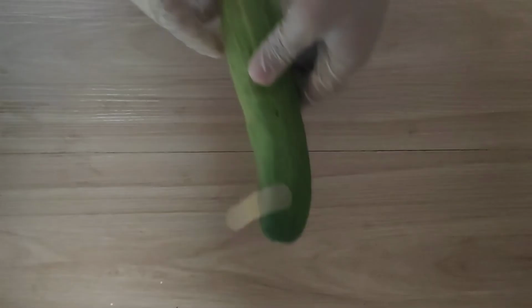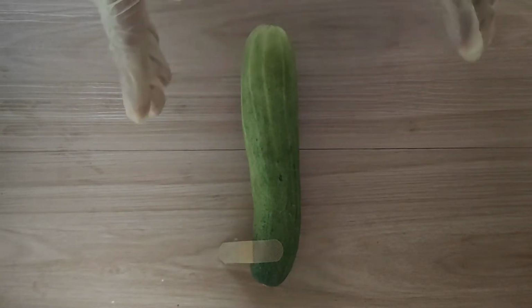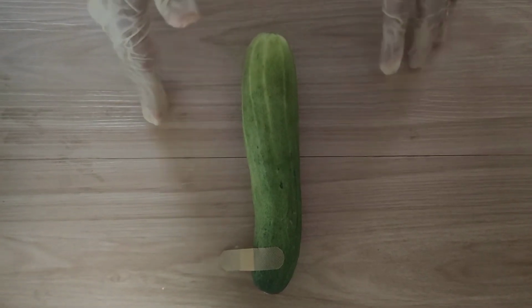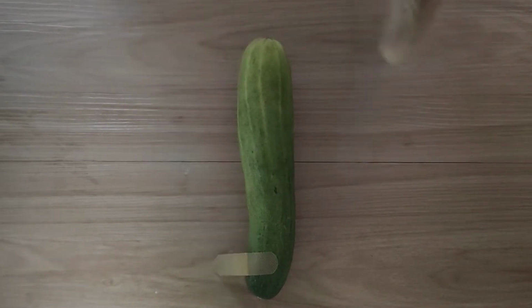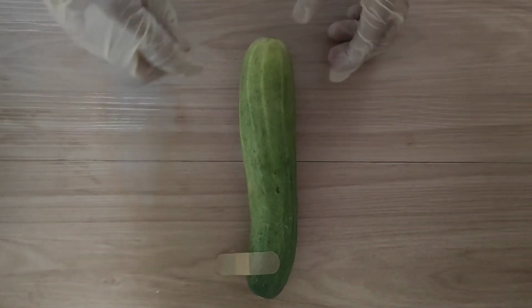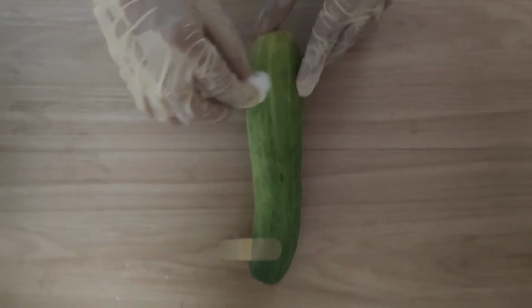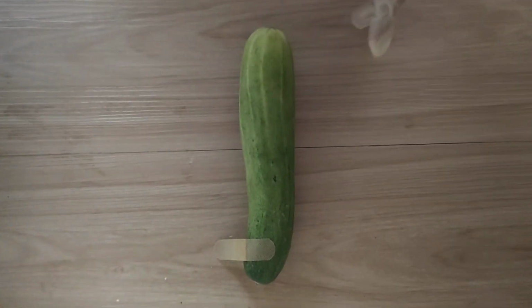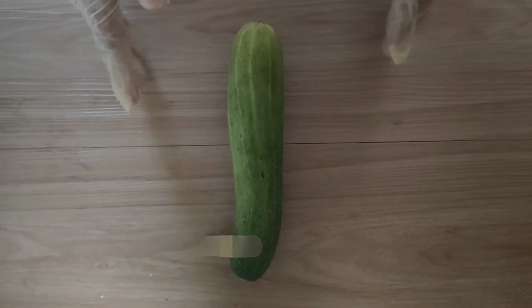Next, prepare the site and fingers used to palpate the site. So assuming that this is the patient's arm. Next, cleanse the selected site in a circular motion outward with povidone iodine prep swabs. Allow to dry. Drying of povidone iodine solution reduces risk of local infection or systemic sepsis.